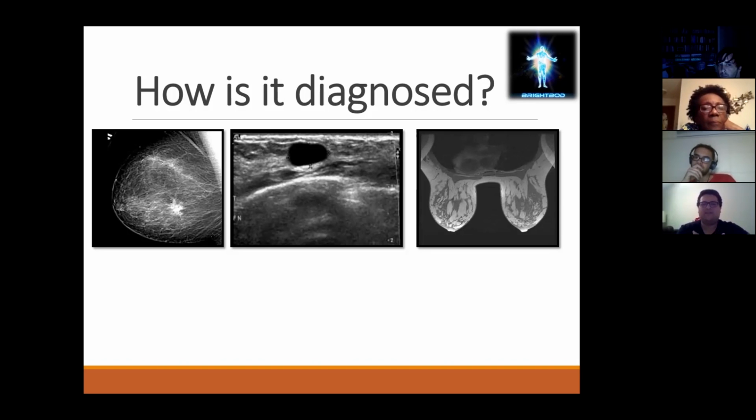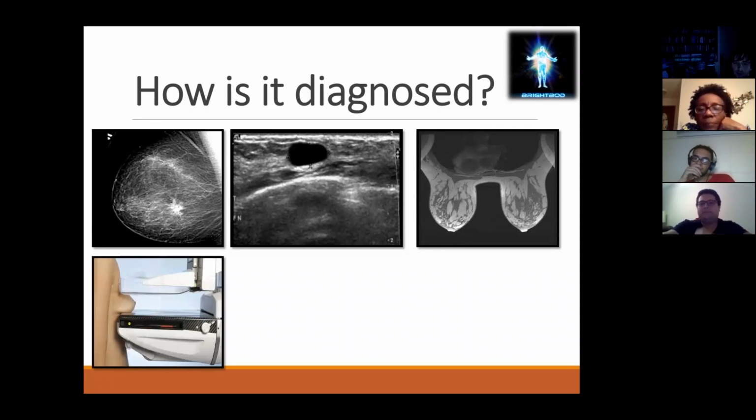it can be a little bit difficult to do the regular mammogram, and it also has certain risks. Of course, if you have ever gotten a mammogram, you know how it is. I'm going to explain to you, but here's a little image of basically how everything is done. So there you see that the breast needs to be like squished, I don't know how to say it, a little bit. So if you have an implant there, it might cause certain problems.